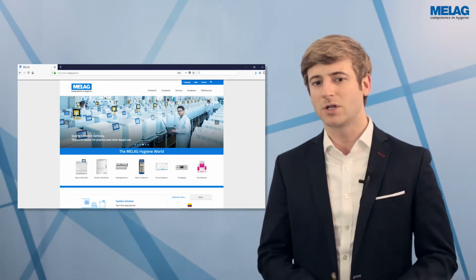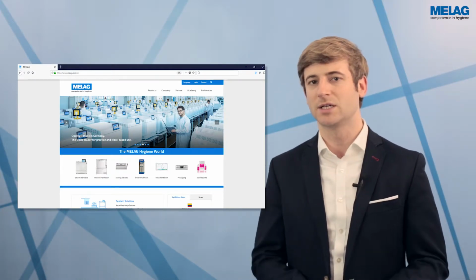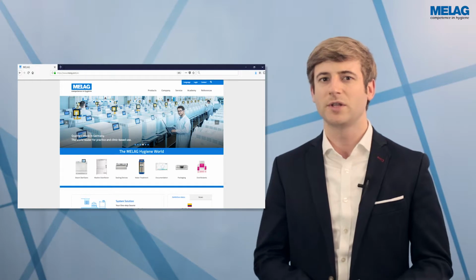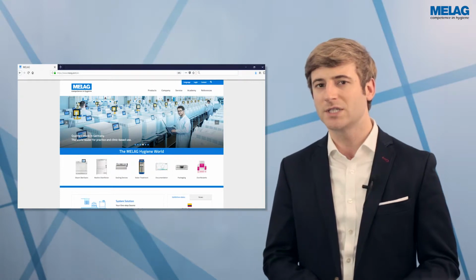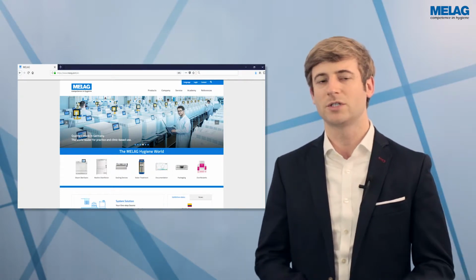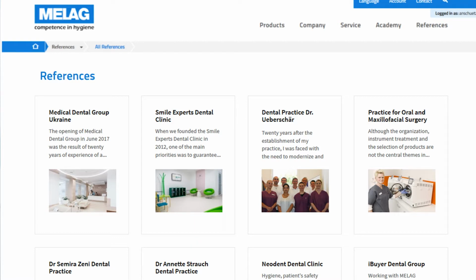So maybe you have also asked during our mini webinar series where we have taken these example clinics from, and maybe you have thought that this might also be helpful for your daily operation. So we have created a reference section with different reference reports that should support your daily business. By clicking on reference on our website, you will be guided to this page where you have a complete overview with different clinics from all over the world, clinics that use the MELAG system solution and that are satisfied with our products. So you might choose a specific report here.